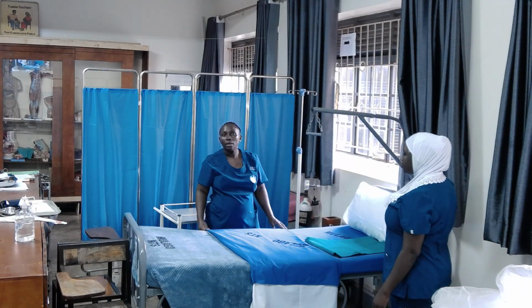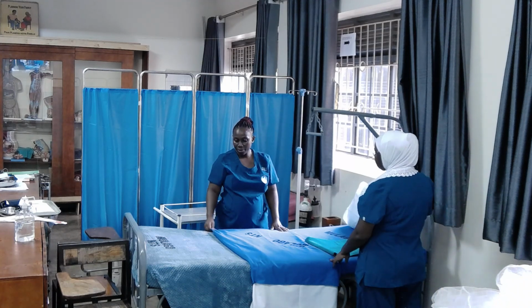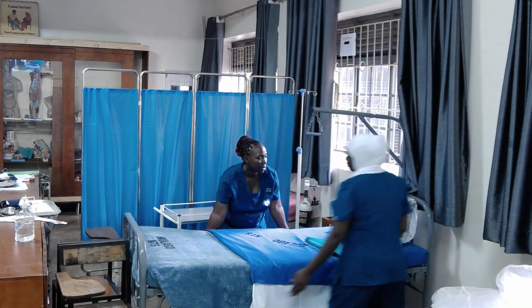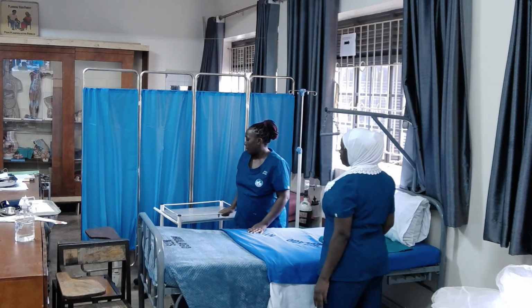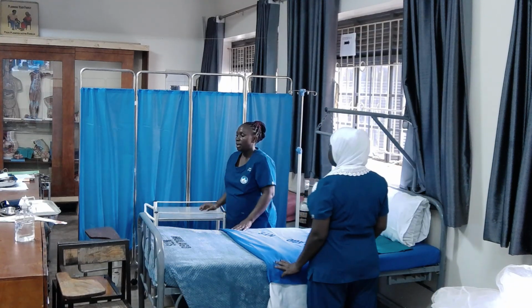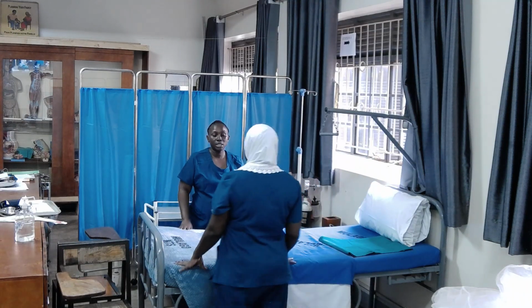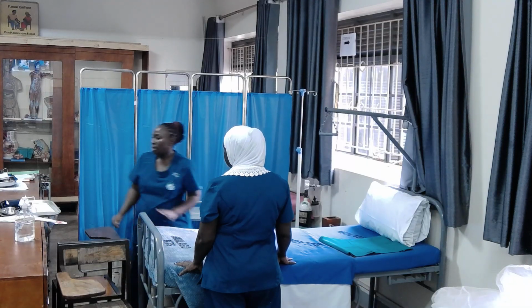So that makes our bed for a patient with head injury. And then after we draw back the bed to the wall, we clear away, remove the screens, ready to receive the patient. So when the patient comes in, we shall raise the side rails. Thank you.